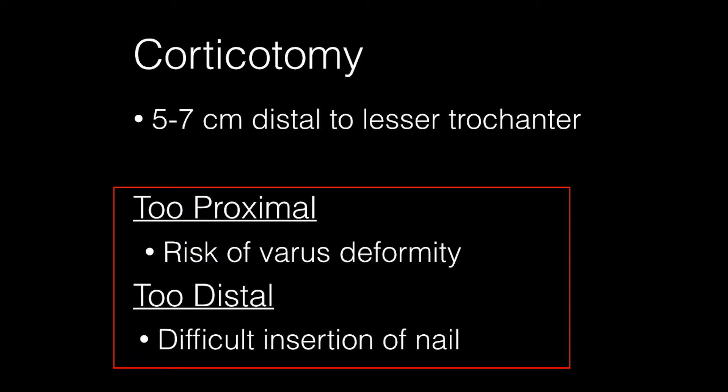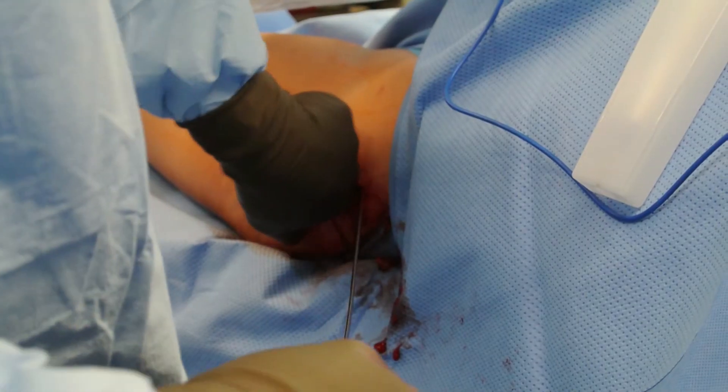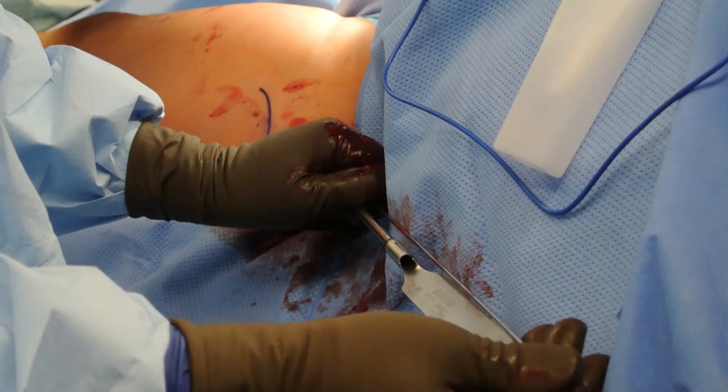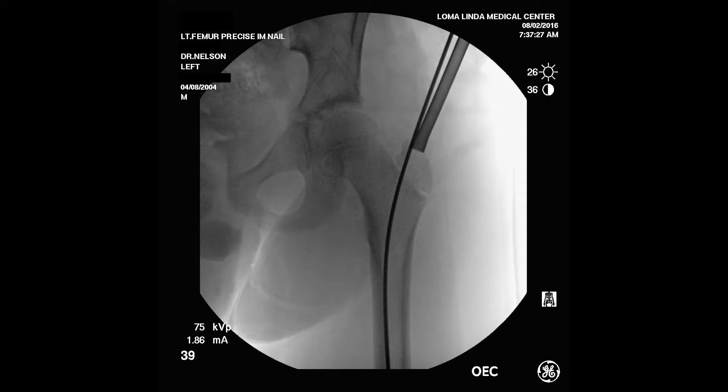If the corticotomy is done too proximal, varus deformity can be created. If it is too distal, then it can be difficult to insert the nail. It is essential that adequate coverage of the distal bone segment be maintained on the thick portion of the nail for stability after lengthening. I usually plan to have at least 2 cm of overlap between the distal segment of bone and the thick part of the nail. The ball-tipped guide wire is then placed into the medullary canal and the length of the bone is confirmed. I like to place the measuring guide beside the guide wire rather than over the top of it, as it is easier and doesn't have the tendency to fall into the entry hole.